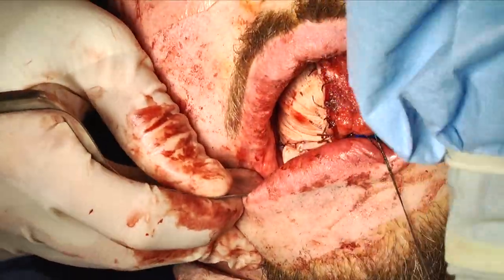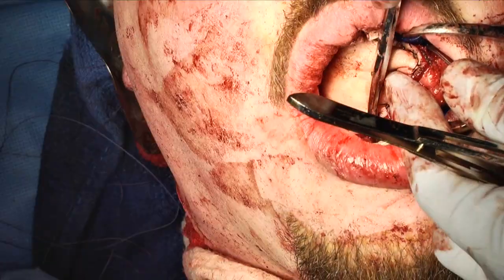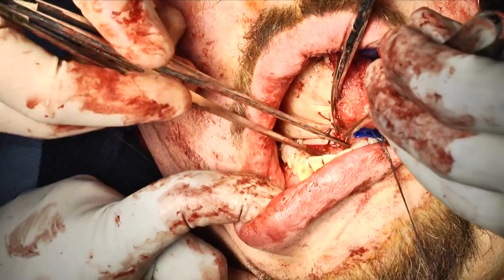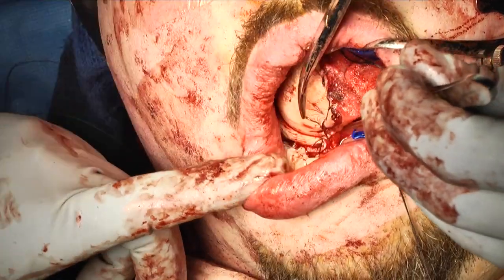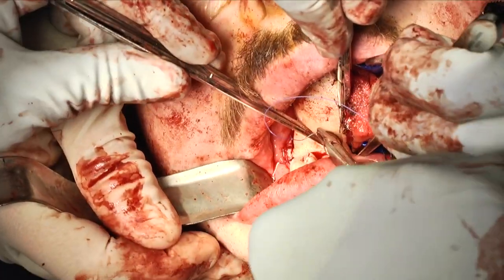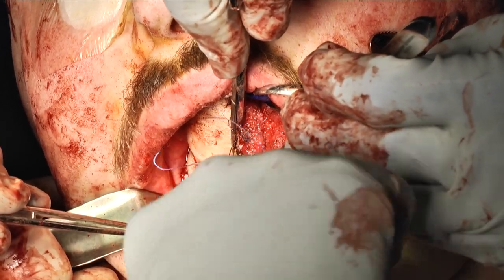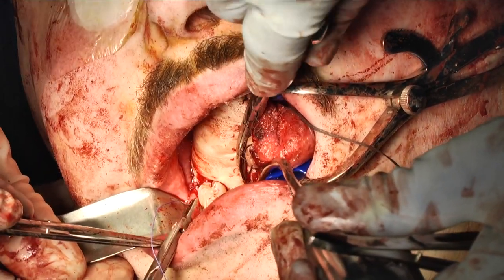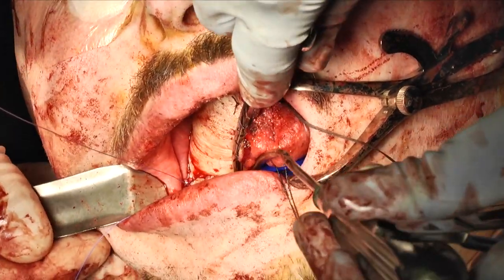The free flap is then taken back to the head of the bed. This part of the procedure is called inset. The flap is circumferentially sewn into place, and you can see here that we've already sewn a fair amount of the free flap into the patient's native tongue in order to reconstruct the right lateral aspect of the tongue. Generally, the free flap is sewn into the native tongue using a series of horizontal mattress sutures with a 3-0 micro pop-off suture type, done around the entire perimeter of the free flap.